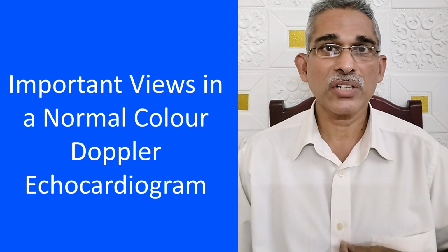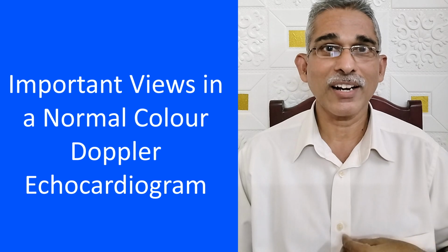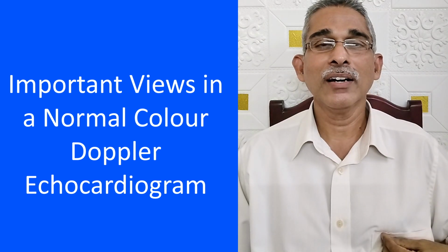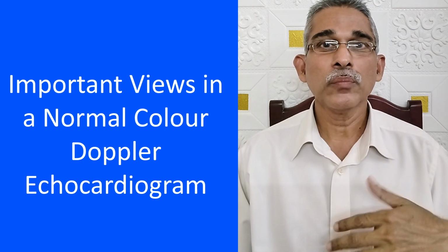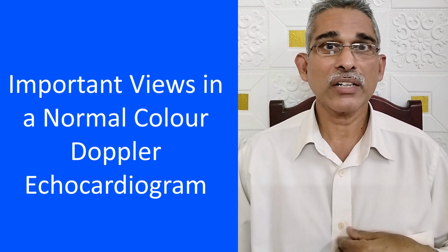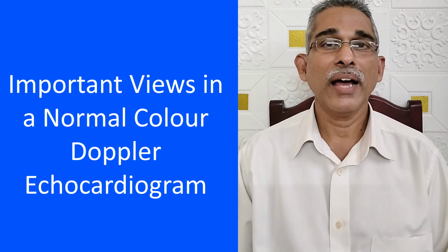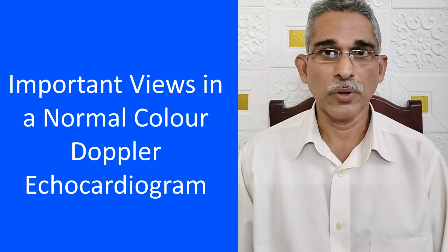Pediatric cardiologists often start from the subcostal view, and they use an inverted view, or what we adult cardiologists call an inverted view. They will say that is the true anatomical view. When you view from the apex, you know that it is inverted, but when you use the inverted view, that becomes the normal pattern, and they are more used to that. And the next view is the suprasternal view, mainly for the aorta, descending aorta, arch of aorta, and suppose there is a ductus or coarctation, that can be better imaged from the suprasternal view.